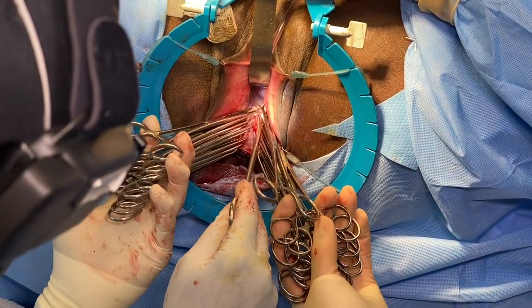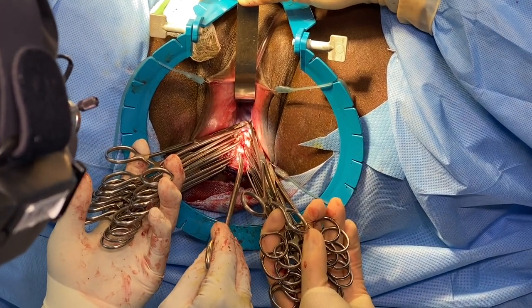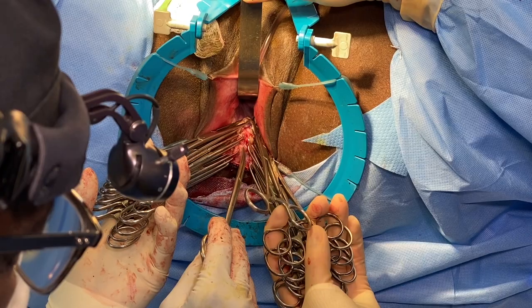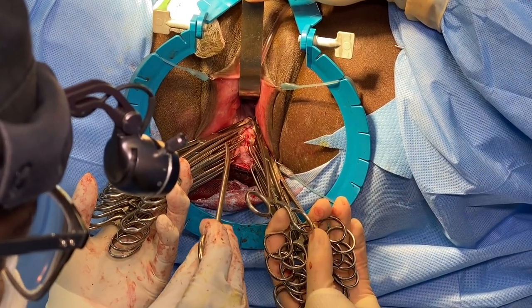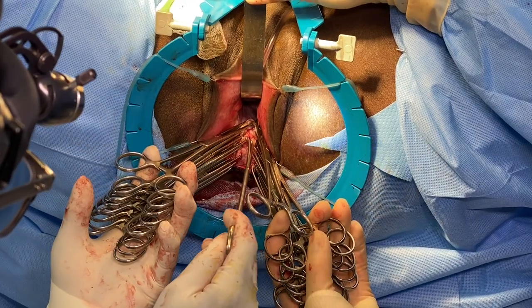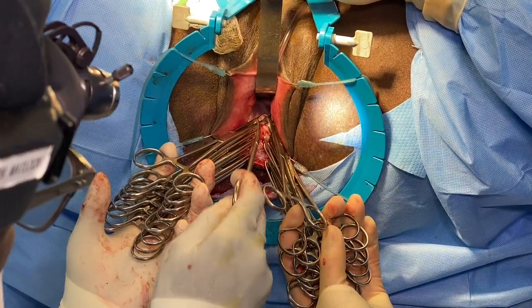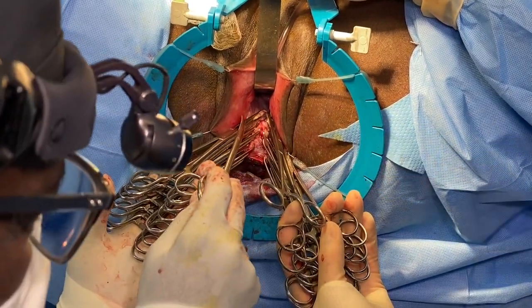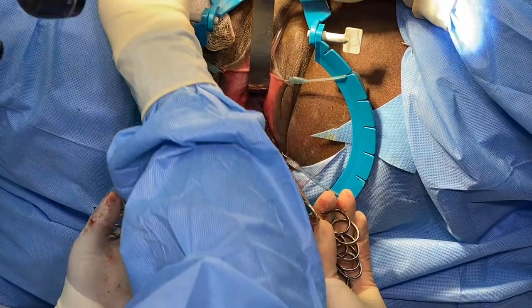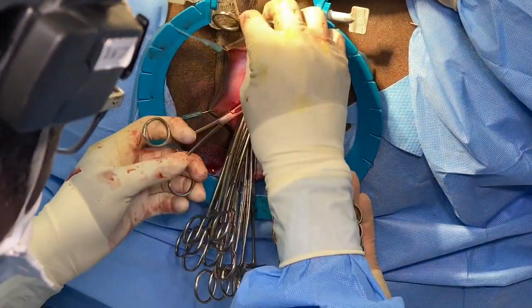Now what we're going to do, we're going to score this pararectal fossa here so that we can take it down so that we can get to the levator ani muscles, the very important pelvic floor muscles, to reconstruct the posterior wall here and give her nice support. Overall, we will decrease the internal diameter, external diameter, and build up the perineal body. She wants to be as if she never had children before. So we're going to start that now.